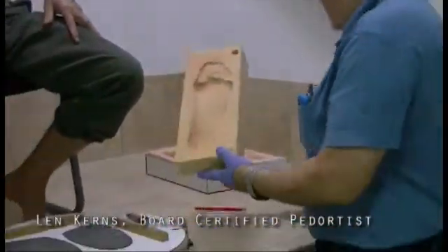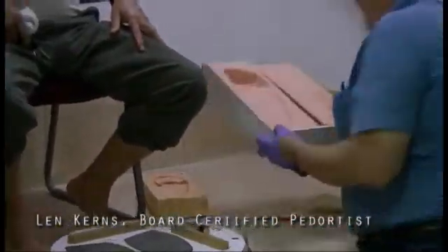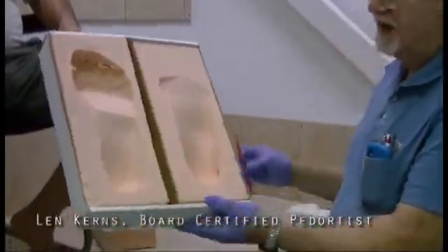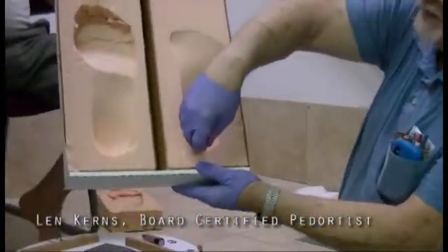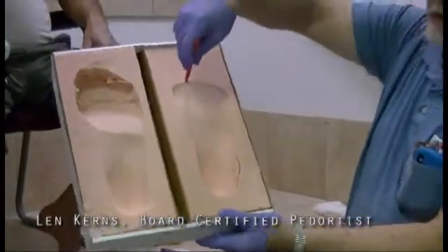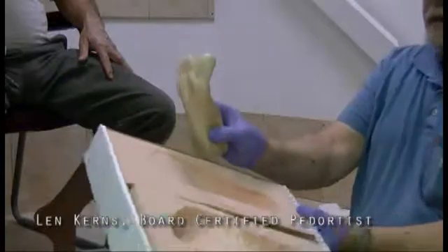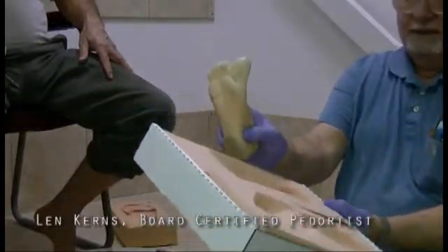If they looked at the first foot, which is very important to see if it was correct, then they would do the second one correct. So I'd get a pair of feet in that would look like this, or this, or a cast, these are demonstration casts, or a cast like this where the heel was all the way down and no toes in the box. Again, the patient must have been walking with the toes pointing up in the air.